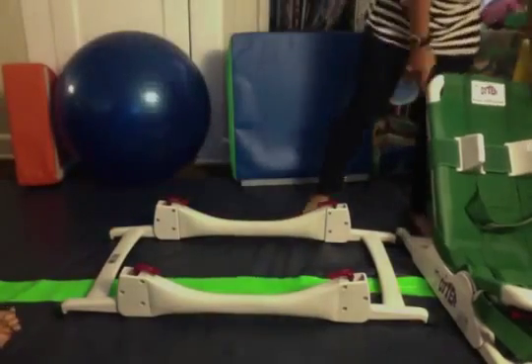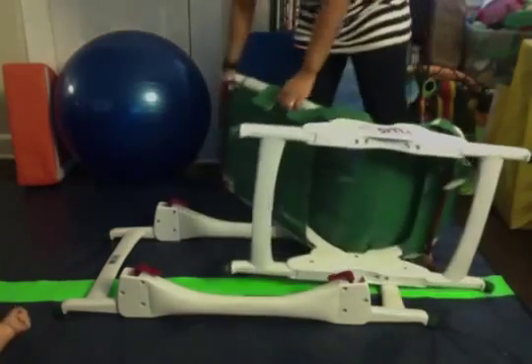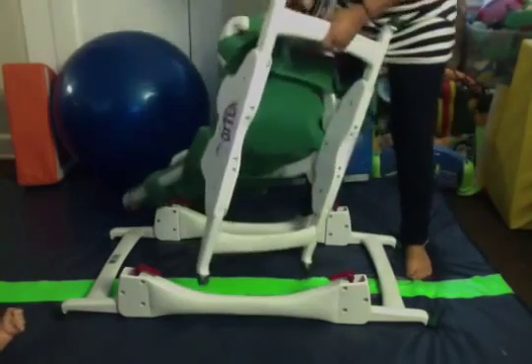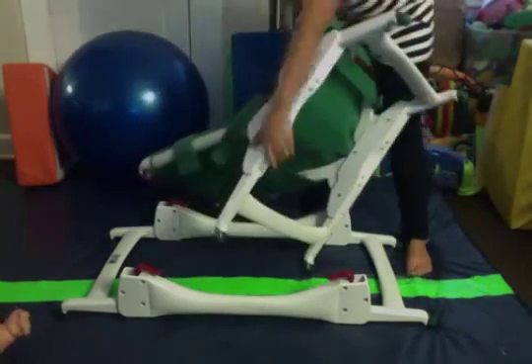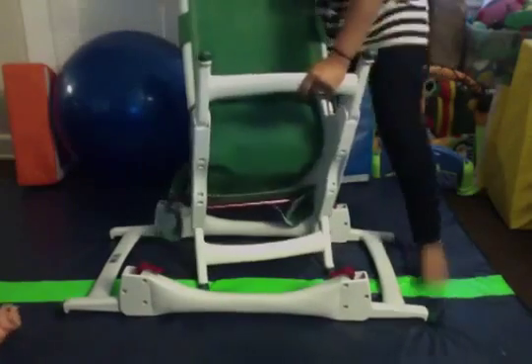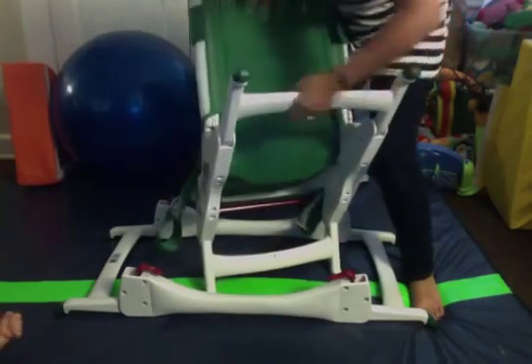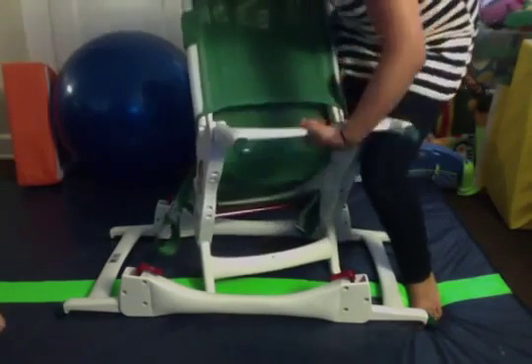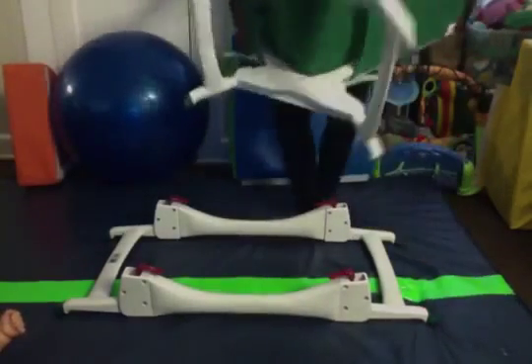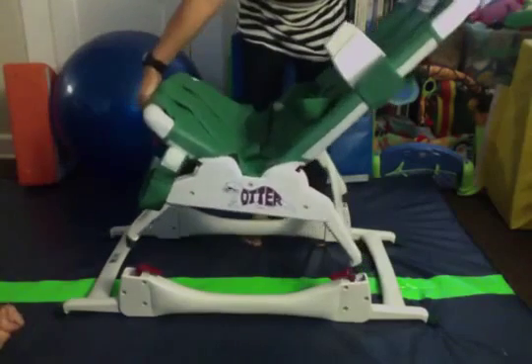When you want to use the stander with the chair, you set it back up to the seating position. Pull that out, push it back up — you're going to pull it out and push it back up, then snap it in.